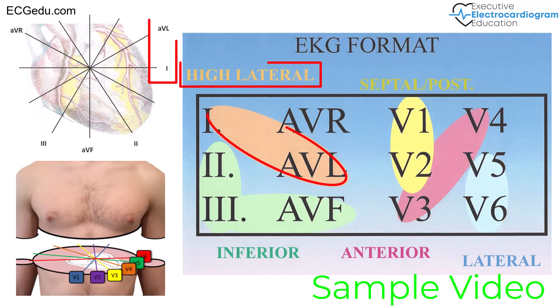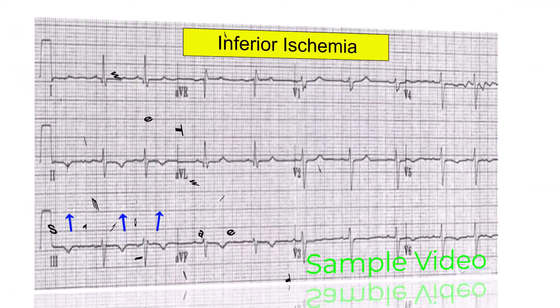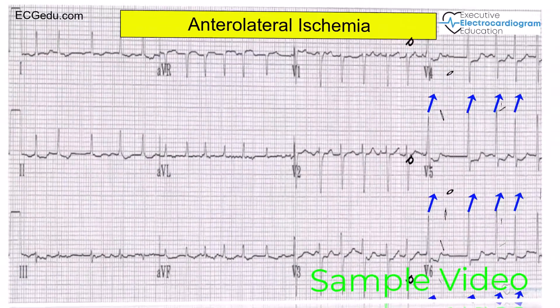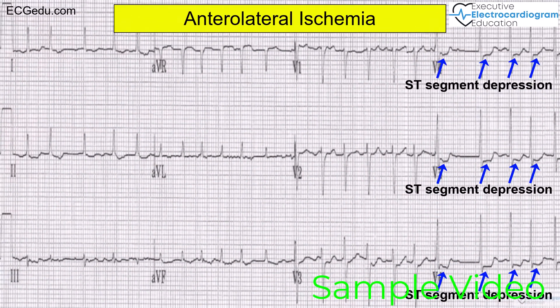Leads 1 and AVL represent the high lateral wall. This ECG has symmetrical isolated T-wave inversion in the inferior leads 2, 3, and AVF — this is inferior ischemia. Lastly, this ECG shows ST-segment depression in the anterior and lateral leads V3, V4, V5, V6. We will call this anterolateral ischemia.